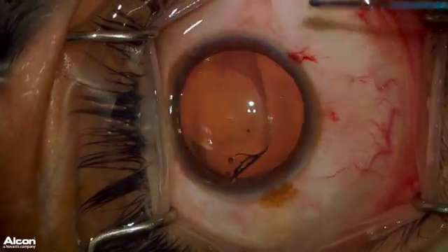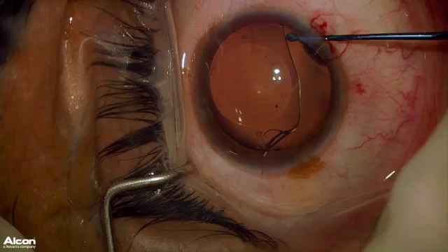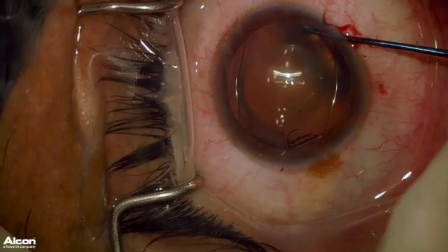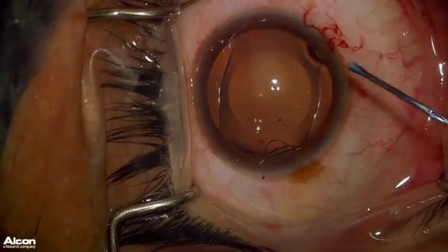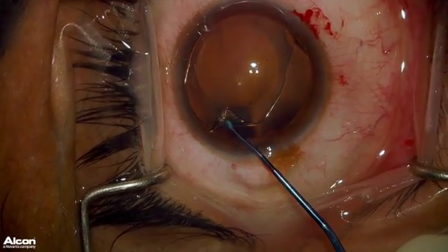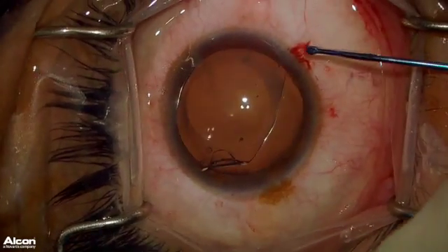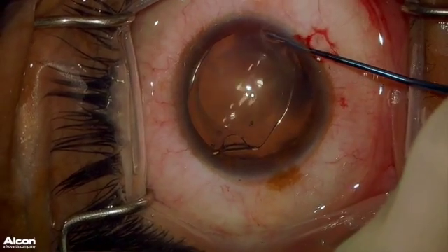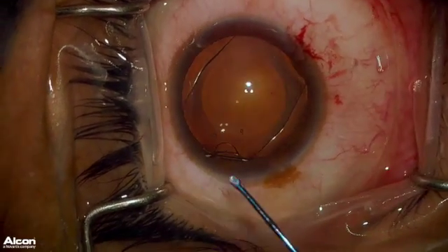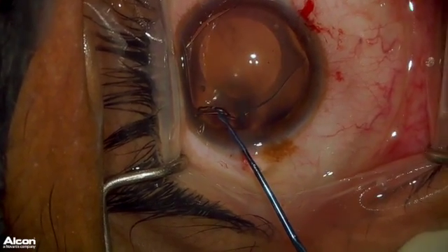For intraocular ICL removal, I like to orient the ICL obliquely with the nasal footplates being along the 4 o'clock meridian and the temporal footplates being along the 10 o'clock meridian. This enables the best access to grasp the meat of the ICL with the lens loading forceps. It is really important to just take your time to get the ICL in the perfect orientation so that you can then grasp the ICL with the lens loading forceps along the 1/3, 2/3 junction of the ICL along the optic. This step needs to be done perfectly to set yourself up for success when removing the ICL from the eye.